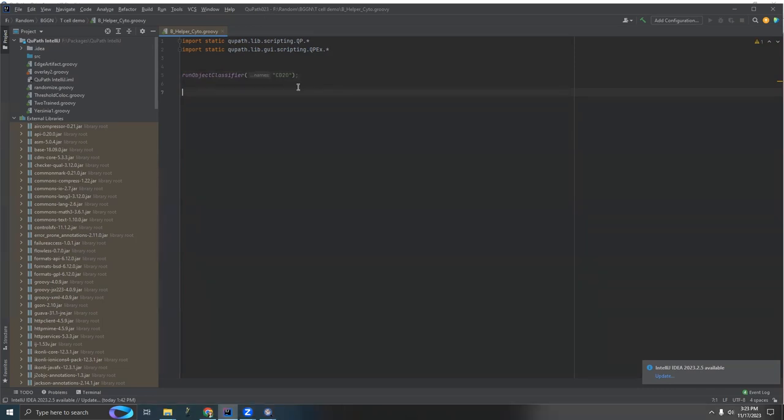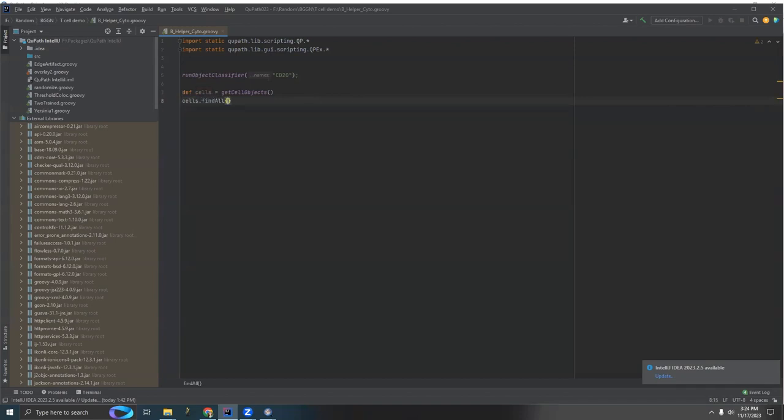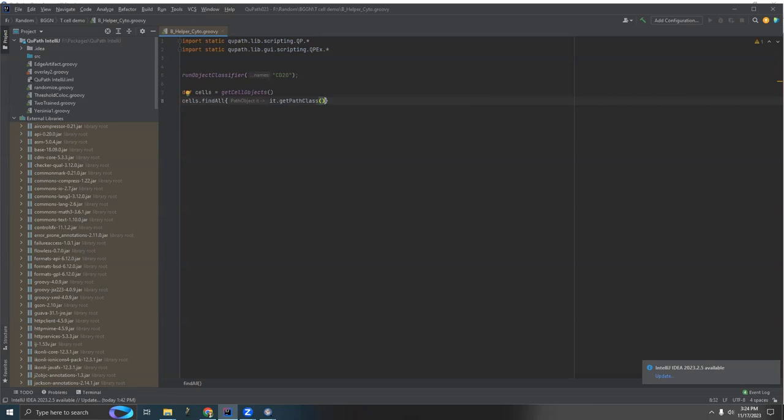I want to separate out the B cells from the CD20 negative cells, and then I'll proceed with the negative cells. So I'm going to start by grabbing all of my cell objects like this, and then I'm going to find the B cells. And for that, I'm going to look within the list of all cells, and I'm going to find all of the individual cells that have the class CD20. And to find them, I'm going to go to dot every cell. I'm going to look through its path class, which is the class I've named, and find the ones that are labeled CD20.